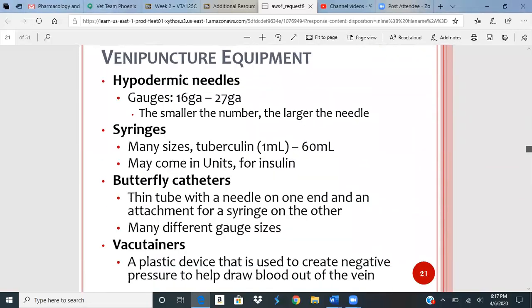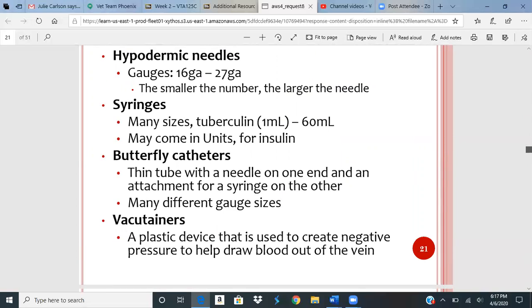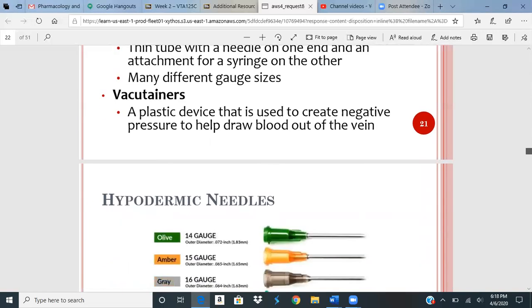Here's your equipment. You guys can kind of look over that. Your needles, syringes, butterfly catheter is just a smaller needle, and it's got a little tube connected to it, almost like a hose. You can put that into your blood tubes, or depending on what you're drawing from, we can do a butterfly catheter in a cat or a kitten because they're so tiny. Syringes, we can go all the way up to 60 mil, which is huge. We wouldn't normally use that in small animal medicine for blood draws.